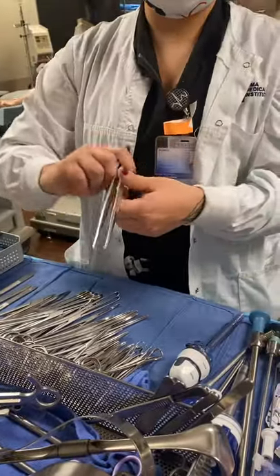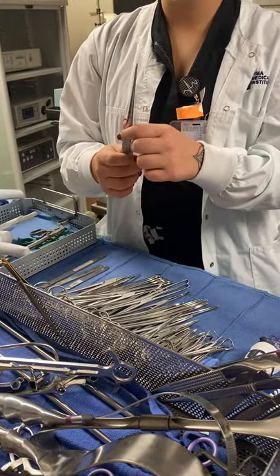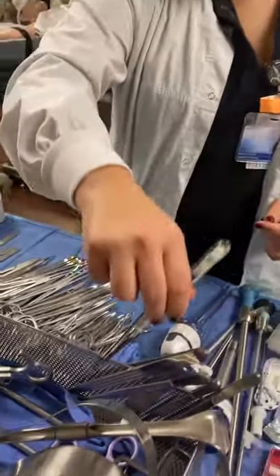Bonnie, one. Bonnie, one. And then tissue forcep? Smooth tissue. Tissue forcep, one. Smooth tissue forcep, one. Smooth tissue, one.